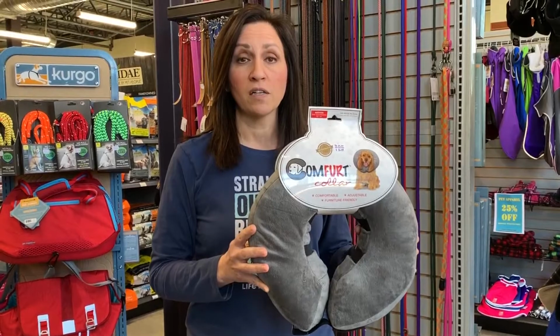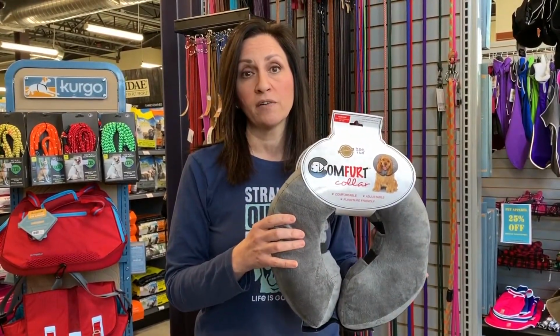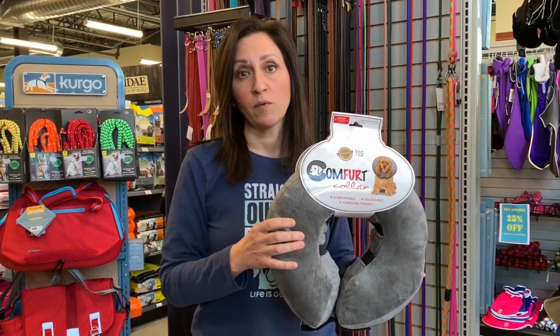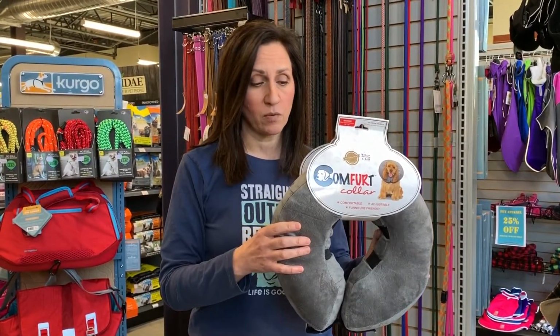It's super important. So this one is called the Comfurt Collar. I like this because it's mushy. It's kind of like a pillow. Again, your dog could kind of rest their chin on it. They definitely have an easier time eating or drinking wearing one of these versus a cone-shaped collar, especially that plastic one like we talked about.